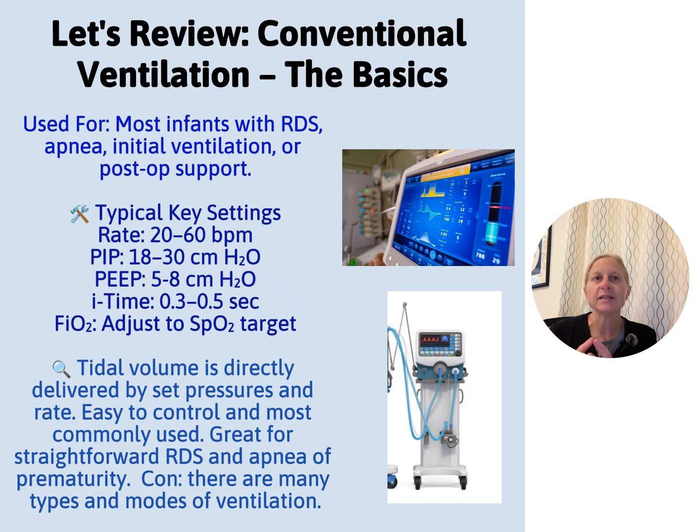But it's really important to know that during the inspiratory to the expiratory time is where the gas is being exchanged. So that PIP over PEEP, the mean airway pressure, all of that is determining how long and how big of a breath the baby has to take in order to exchange those gases.